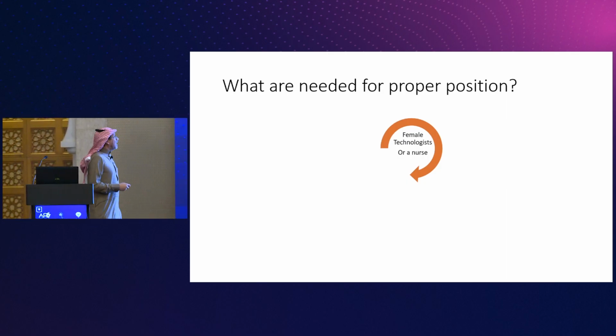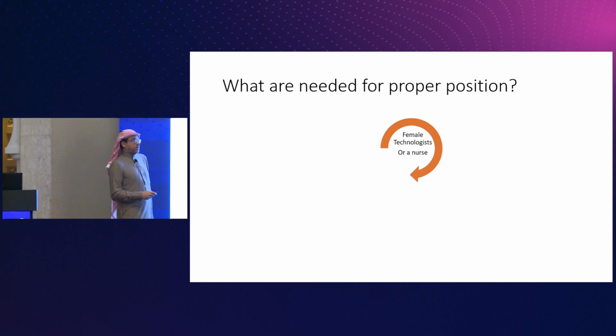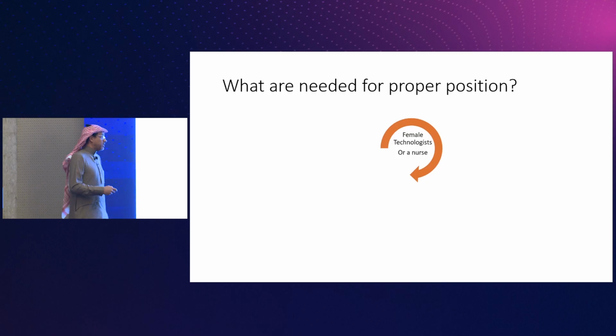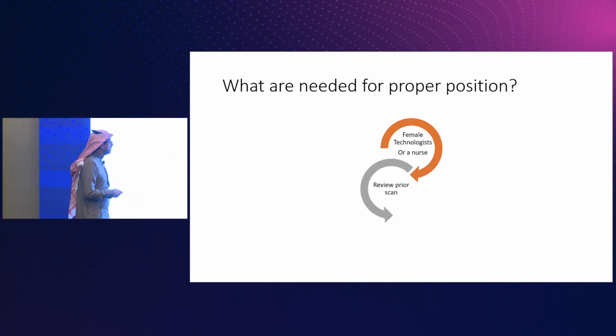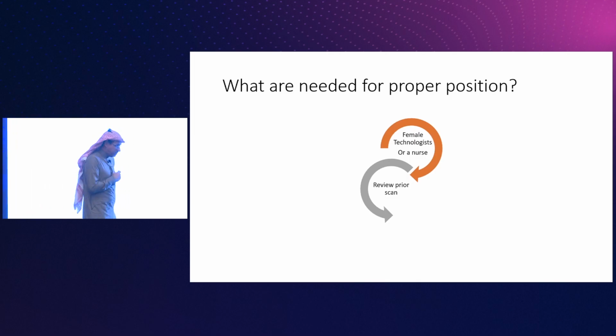Okay, what is needed for proper positioning? First, a female technologist or nurse. Certainly, even in Europe, there is no male positioning breast. But what does it mean by having a female technologist?